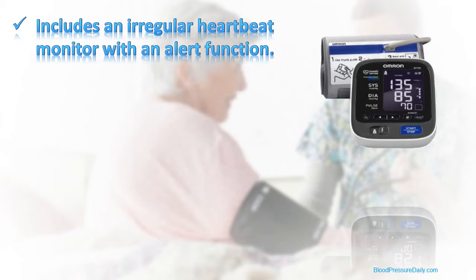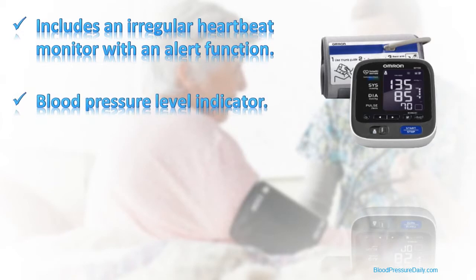Also, over and above the standard numerical readings, the BP-791 displays a blood pressure level bar, so that you can see clearly how your pressure readings compare to internationally recognised blood pressure guidelines.